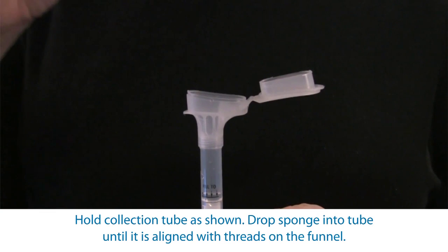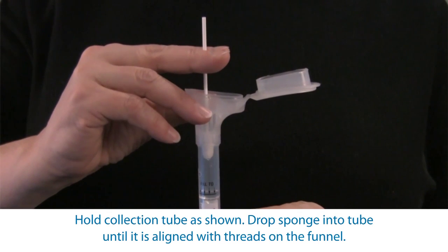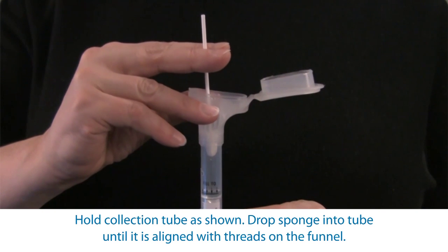Hold the collection tube in one hand as shown and drop the sponge head partway into the tube so that it's aligned with the threads on the funnel.